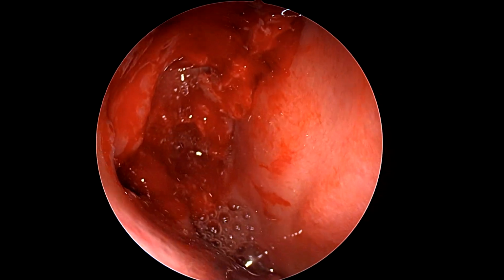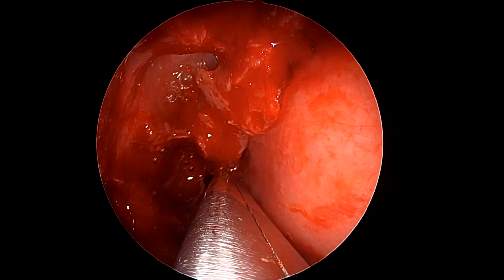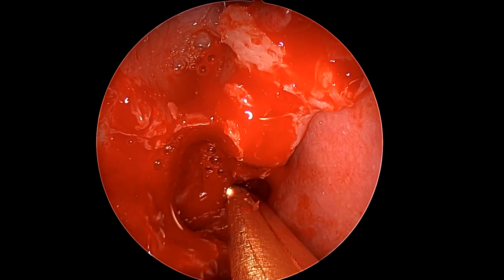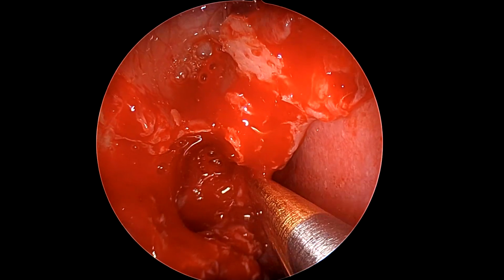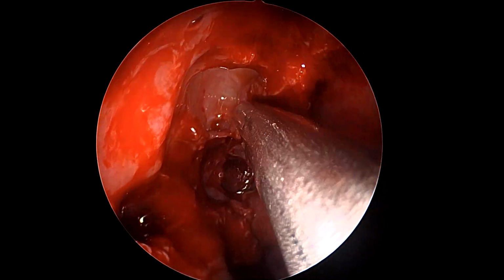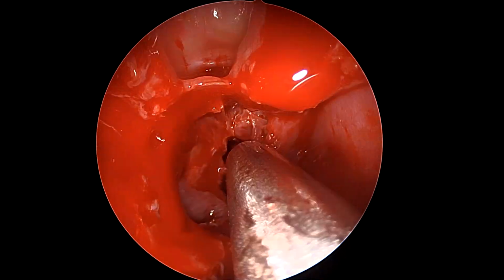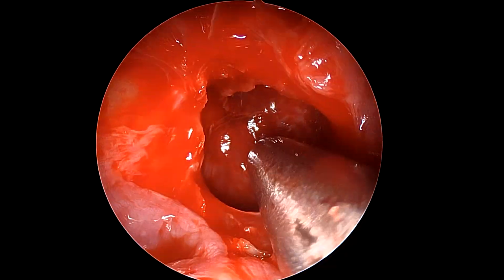So once on the right side, where we need more superior as well as lateral access for the vasculature and near total removal, we have gone not just on a midline sphenotomy, but through a standard approach converting into uncinectomy, antrostomy, and complete ethmoidectomy. The ethmoidectomy here is very important because the tumor has a suprasellar extension, and for suprasellar access, we need to have the entire fovea ethmoidalis roof in picture and not just the sphenoid.